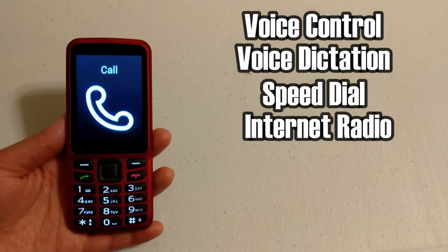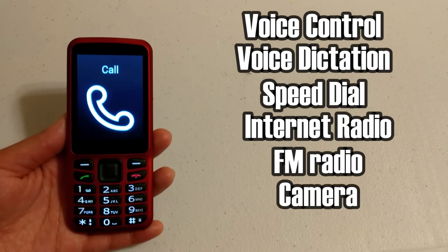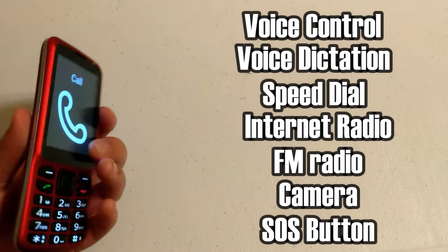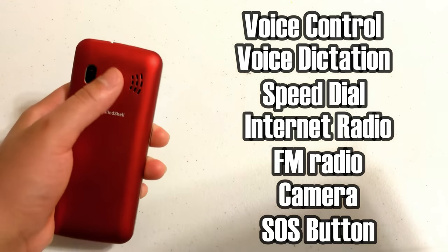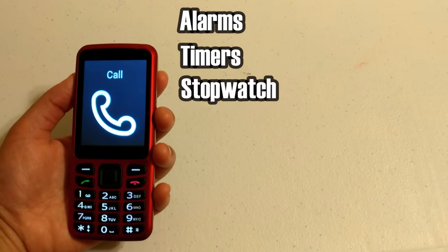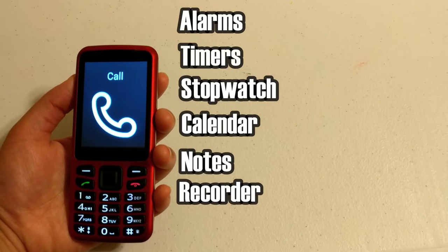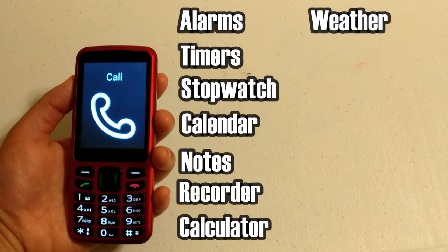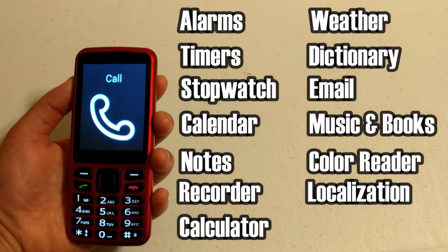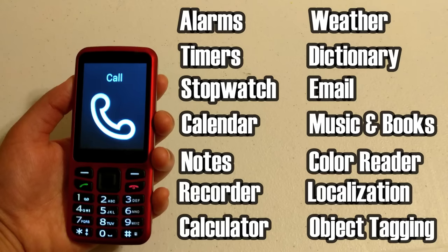It has voice control, voice dictation, speed dial, internet radio, FM radio, a camera where you can add voice descriptions to your photos, and an SOS button on the back. You do have to set it up before you use it. It also has alarm, timer, stopwatch, calendar, notes, voice recorder, calculator, weather, dictionary, email, music, a book player, color identifier, localization where it can tell you where you are, and object tagging.